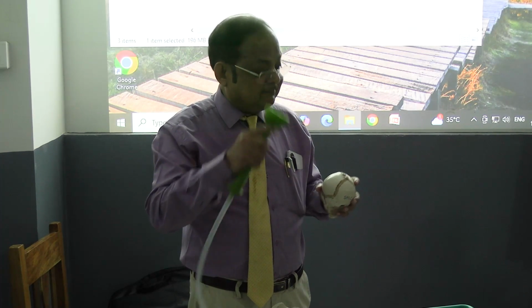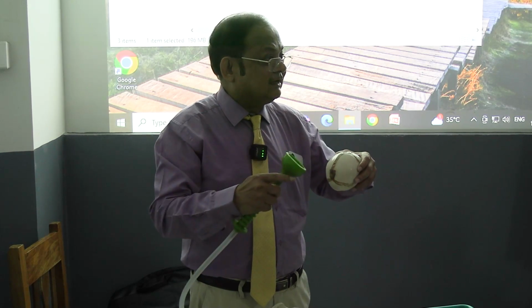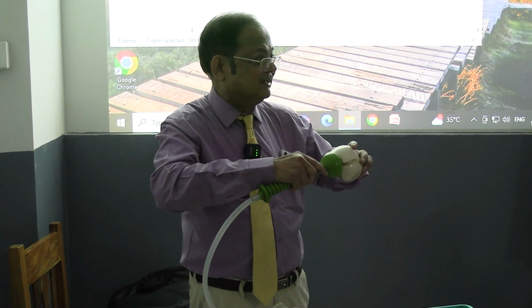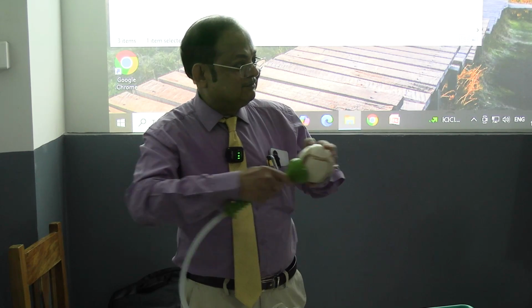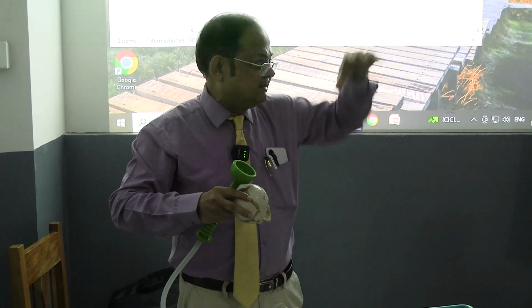And another advantage of ventouse is that there is no need for a specific cephalic or pelvic application. Suppose the head is not rotated. If you apply it, what will happen? There is auto-rotation, and it will follow the mechanism of labor.